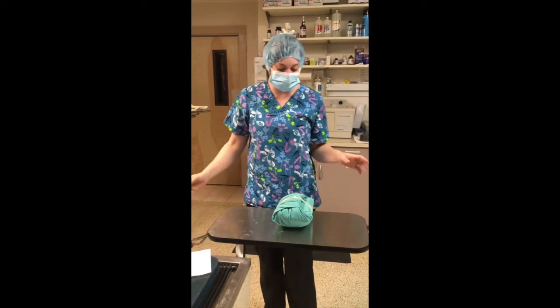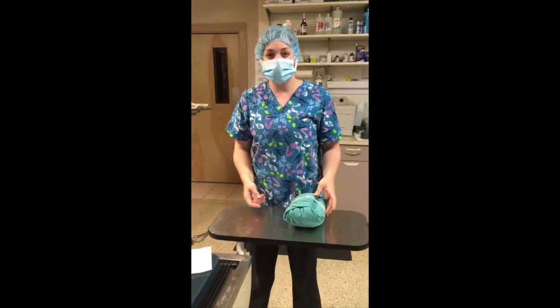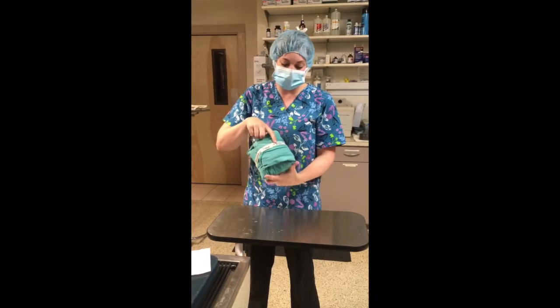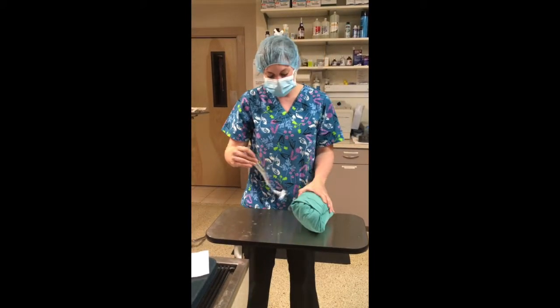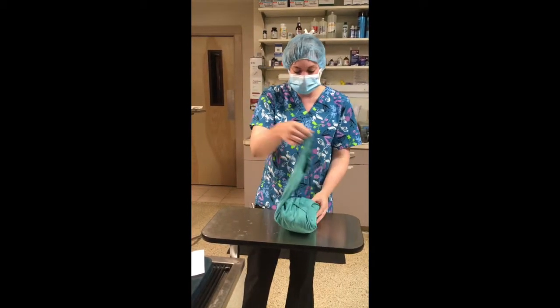All right, I'm going to demonstrate opening up a sterile surgical gown and gloves to prepare for scrubbing in for a surgery. You can see that it is labeled gown. It's in the correct sterility date from the autoclave, and it is sterile according to the indicator strip tape. So we're going to pull that off to open this up.